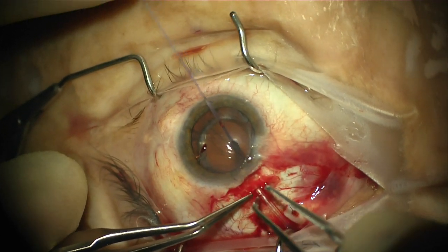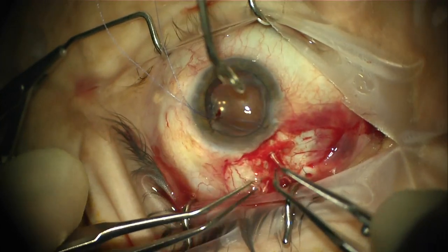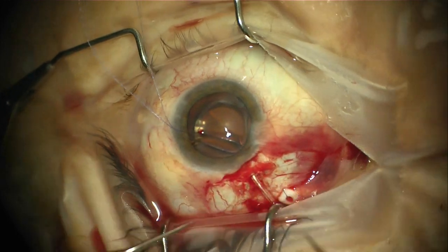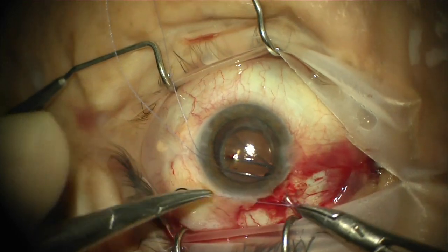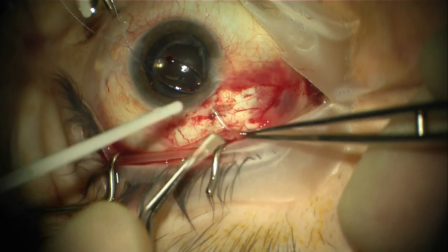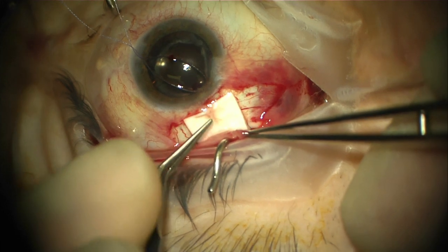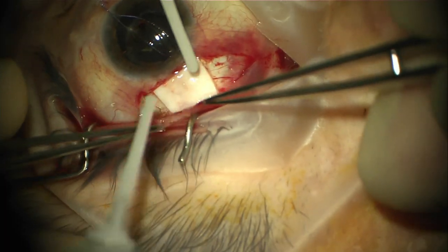The sclerostomy is placed into the sulcus, and tying forceps are used to feed the tube through that sclerotomy with the position confirmed in the sulcus. The tube is then secured in the typical fashion using suture to the sclera. A patch graft of surgeon preference is then secured over the anterior portion of the tube using glue or suture.